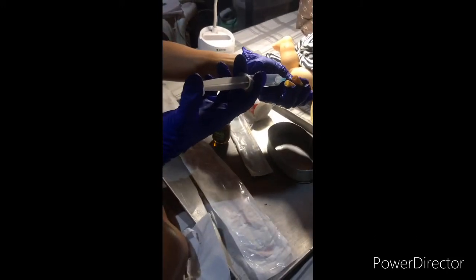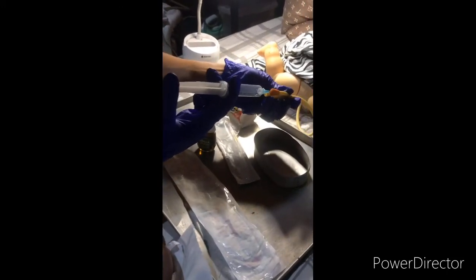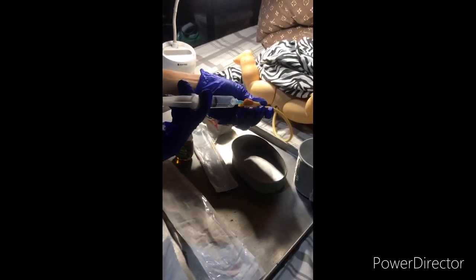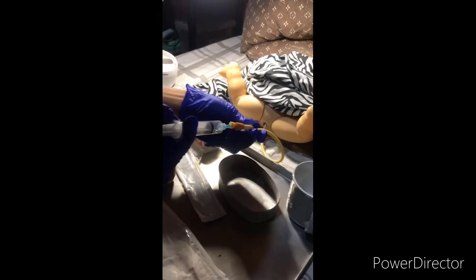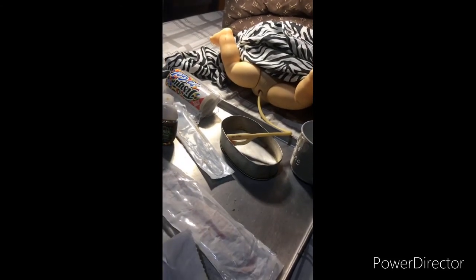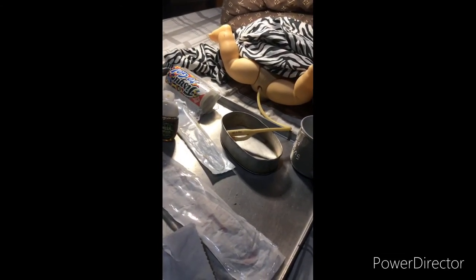Tape catheter. Female client: tape catheter to the inside of the thigh with strip of non-allergic tape. Allow for slack so that movement of thigh does not create tension on catheter. Male client: tape catheter to the top of his thigh or lower abdomen. Allow for some slack in catheter so that movement does not create tension on the catheter. Anchoring of the catheter minimizes trauma to urethra and meatus during client's movement.